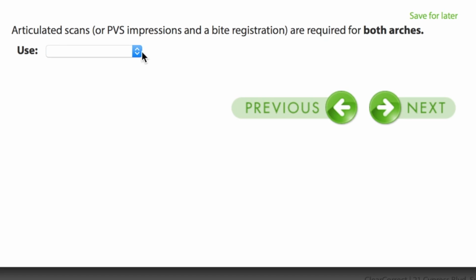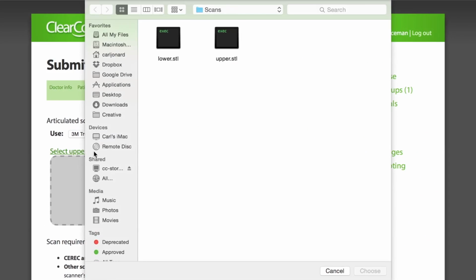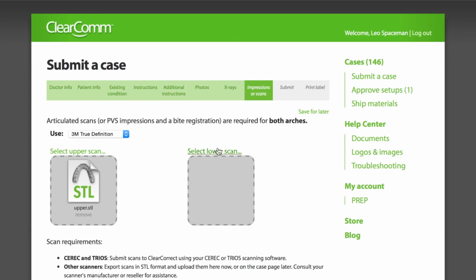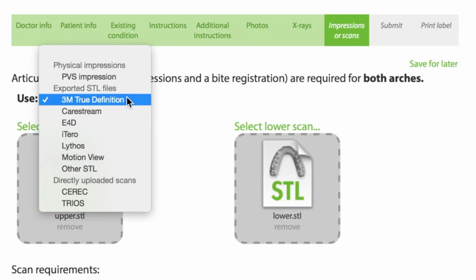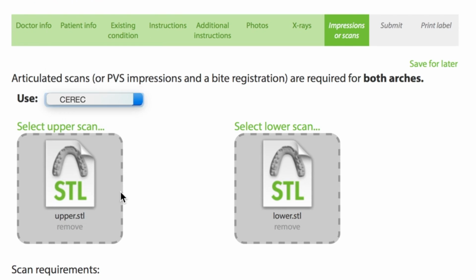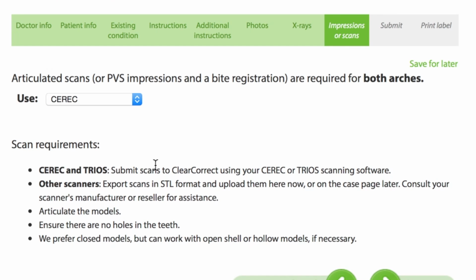If you have STL files exported from your scanner, drag them into the gray drop zones to upload them, or click the file selection links. If you select Directly Uploaded Scans, we'll keep an eye out for files uploaded directly from the selected scanner that match your patient's information. This works best if you submit your case on doctor.clearcorrect.com before uploading scans through your scanner's interface.